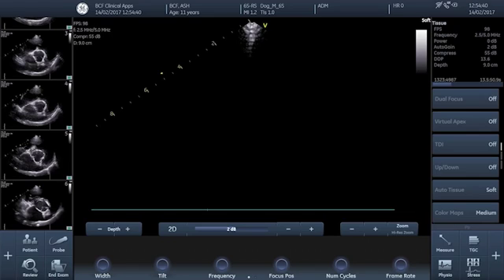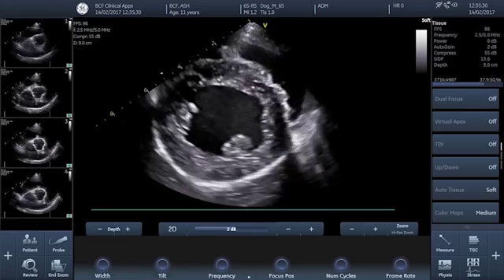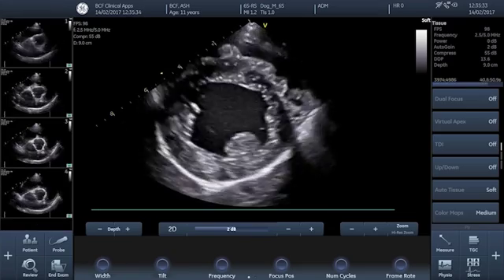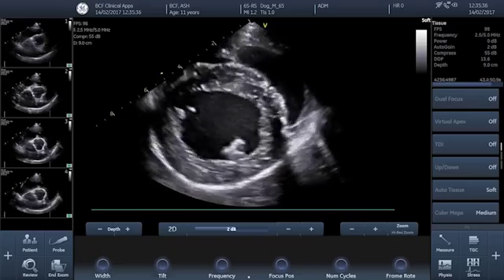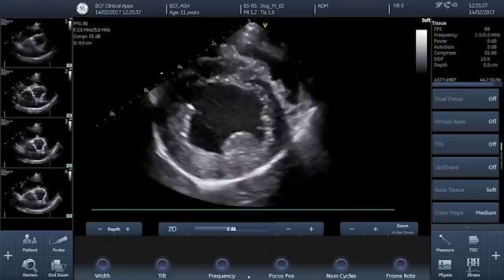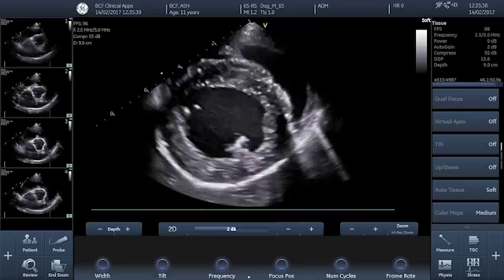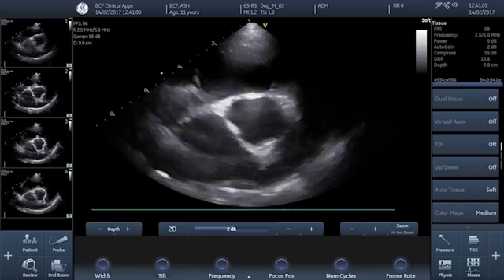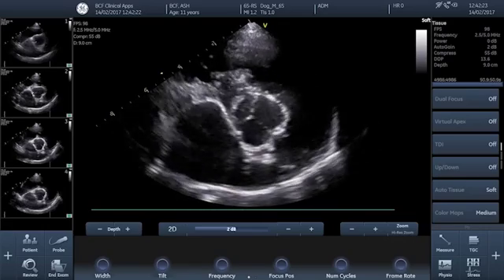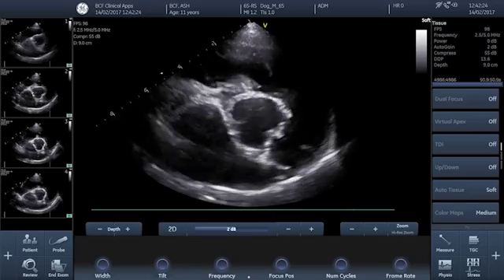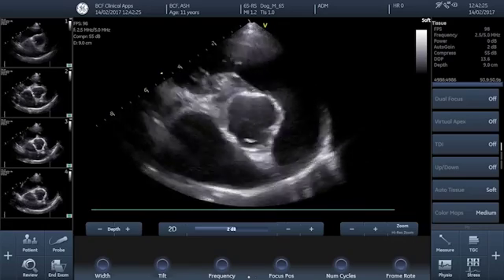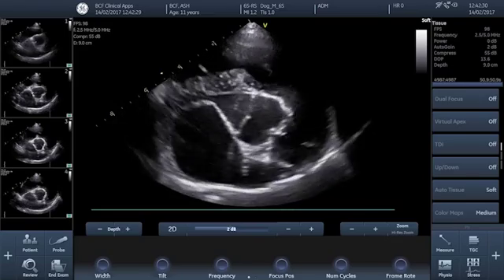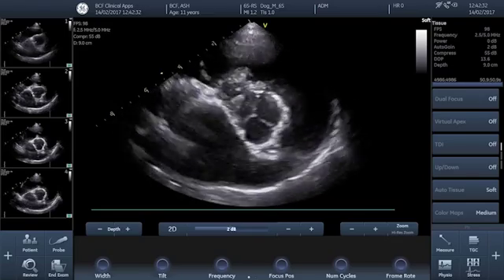We'll start by popping our probe on the dog and acquiring a short axis view at the level of the papillary muscles, and then by fanning dorsally away from us we're going to go through the fish mouth view at the level of the mitral valve and then we'll arrive at our ideal view — the short axis view at the level of the aortic valve through the base of the heart.